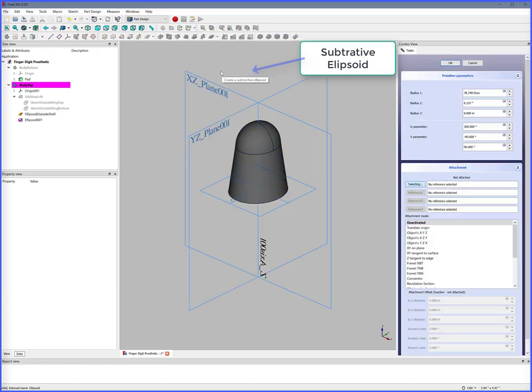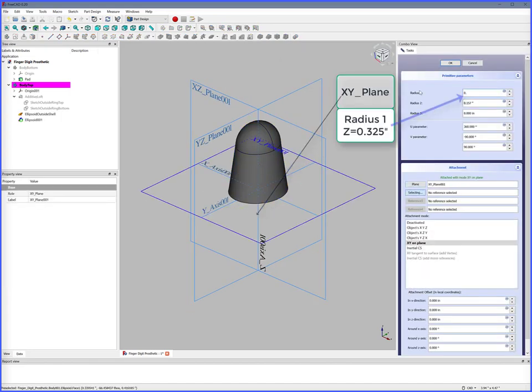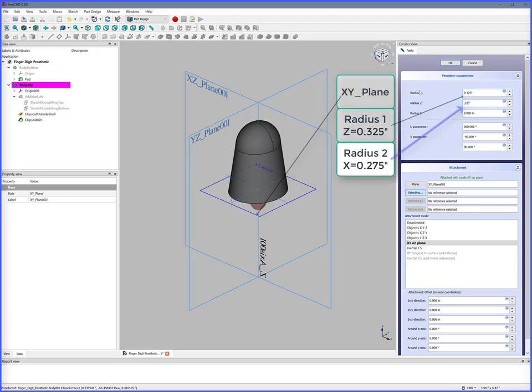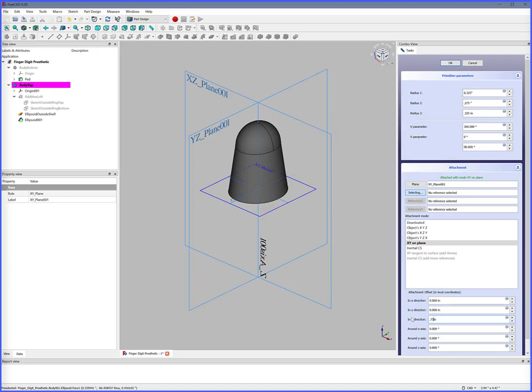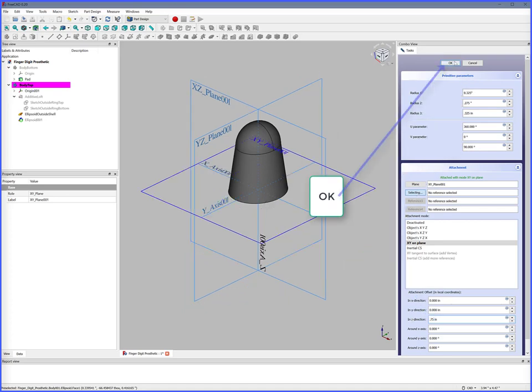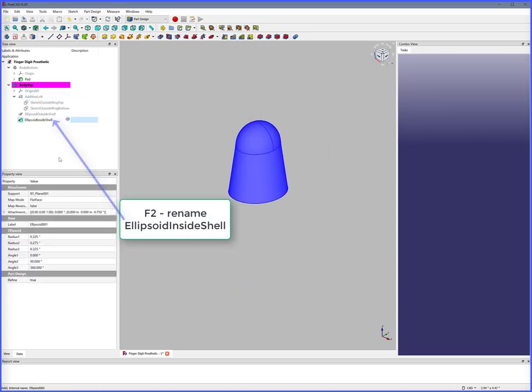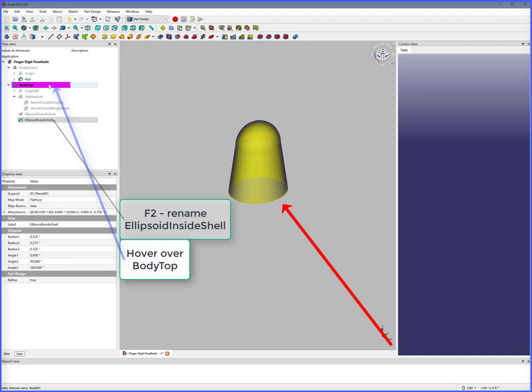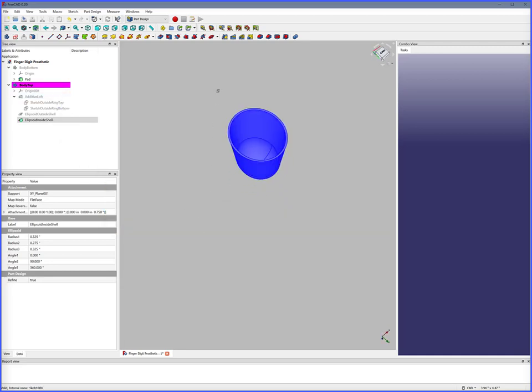Subtraction of ellipsoid, XY Plane. Radius 1: 0.325, Radius 2: 0.275, Radius 3: 0.325. V Param equals 0 degrees — this makes a half ellipsoid. Move in Z direction 0.75 inches — this moves the half ellipsoid to the top. OK. Rename to Ellipsoid Inside Shell. Hover over Body Top to see ellipsoid shell. Ellipsoid shell half has been added to the top of the sloped cylinder body.